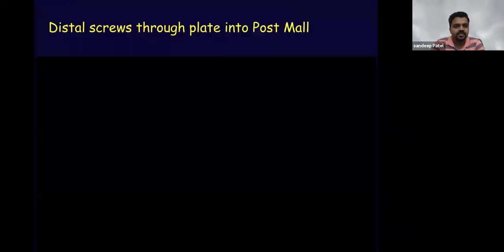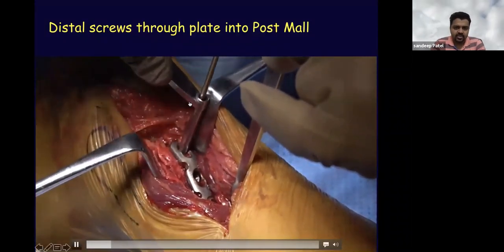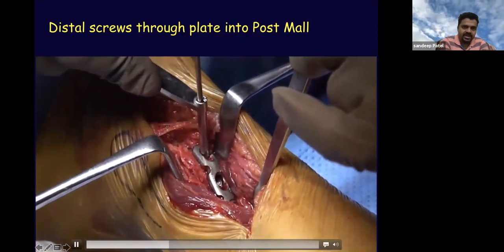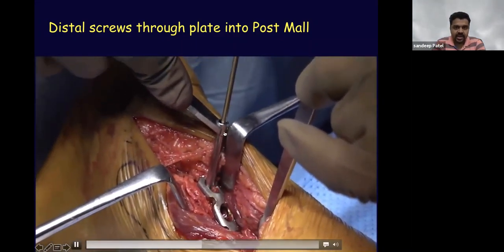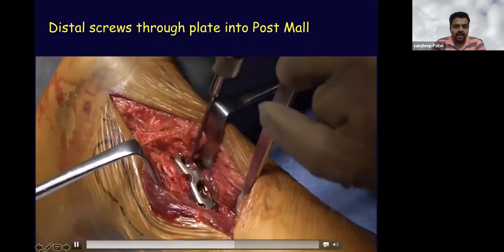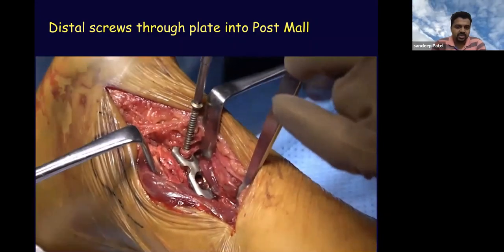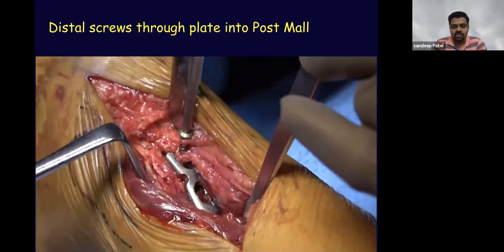Next, even though the reduction is achieved, we want to put in a screw through the posterior malleolus. I have deliberately directed it distally so that it goes away from the joint, and adjusted the anterior-posterior direction. We check the depth — in Indian patients we typically get a length of 38 to 42mm. This screw goes through the plate and through the posterior malleolus to achieve reduction. The posterior malleolar component is now done.